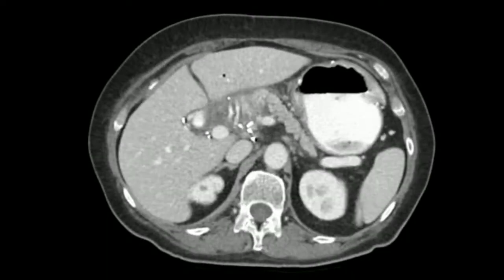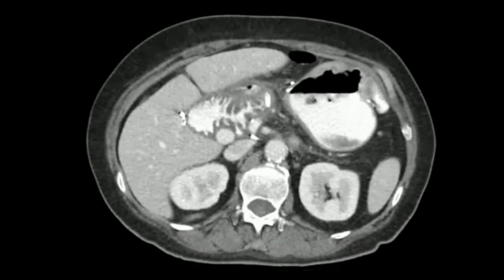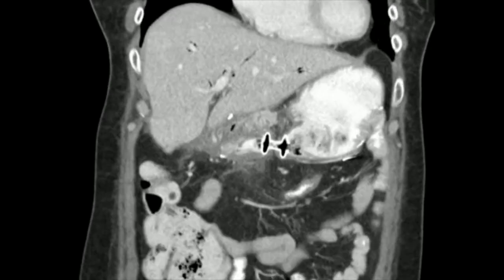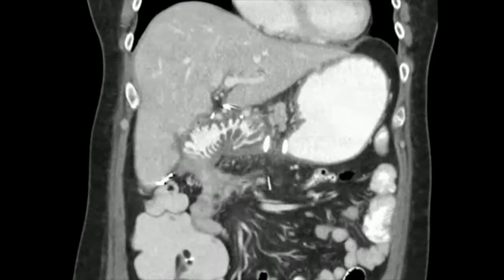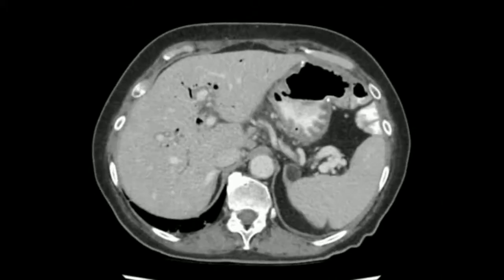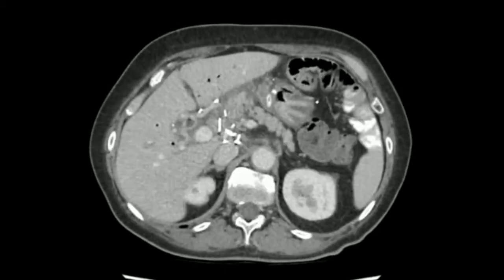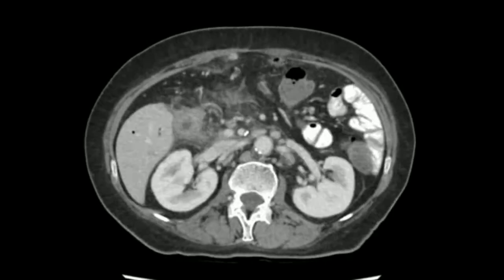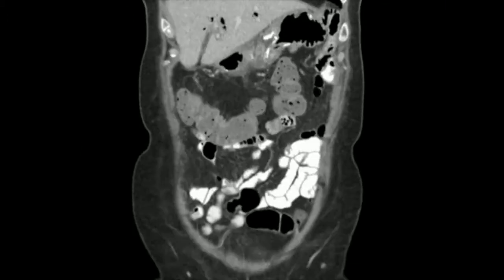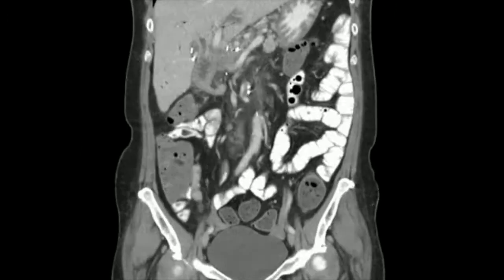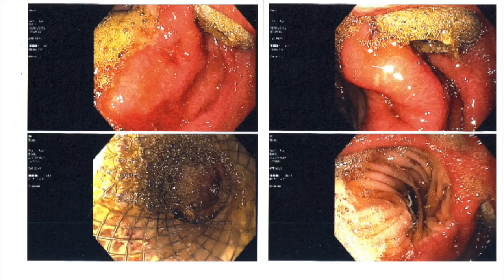The scan a day later showed full patency of the stent with air in the intrahepatic bile ducts. The stent was fully patent a month later on a CAT scan. A gastroscopy showed good positioning of the stent.